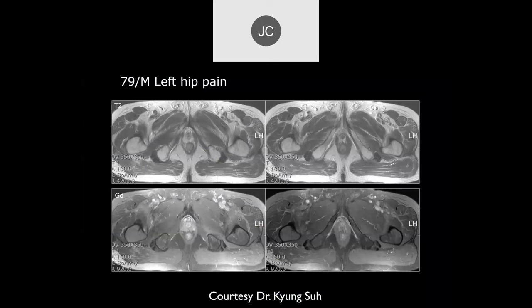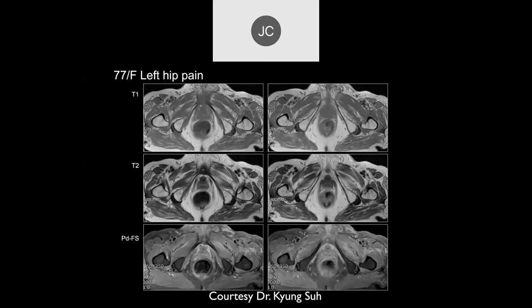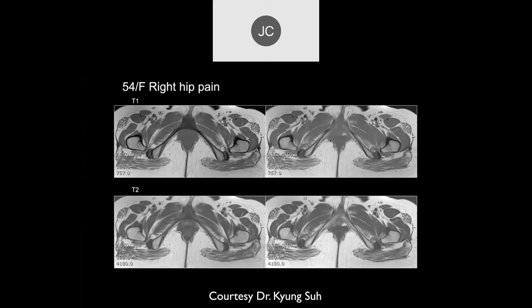79-year-old male with left hip pain. There's some narrowing of that ischial femoral distance — the main narrowing is the quadratus femoris distance, worse on the left than on the right. There's not much edema here, but this is quite severe and the patient was symptomatic. It's bilateral, which is common. This is much more common in females than males because the female pelvis is wider congenitally, but you can see it in both sexes.